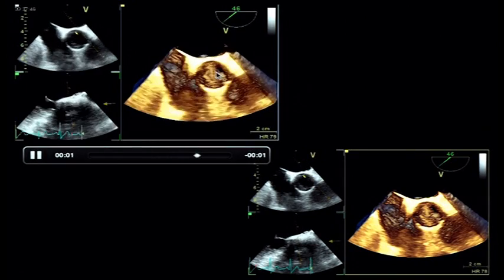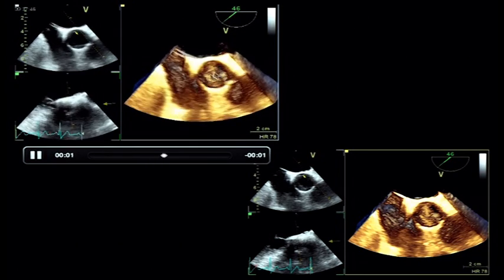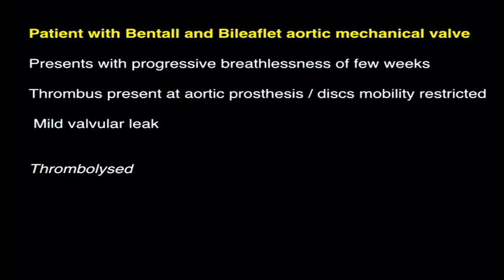So severe obstruction. And again, the transthoracic is not very contributory in terms of the aortic valve, and he underwent a TEE, and the TEE showed a soft tissue shadow here and a density which is suggestive of a thrombus here. And you can also see that the leaflet movements are also not good, and the flow is obstructed in one orifice, and there's turbulence over there. And then if one switches on to the 3D TEE, you can easily make out that this irregular shaggy area is a lot of thrombus which is causing the obstruction, and this was what his problem was. And this patient also underwent thrombolysis, and so far he's okay.